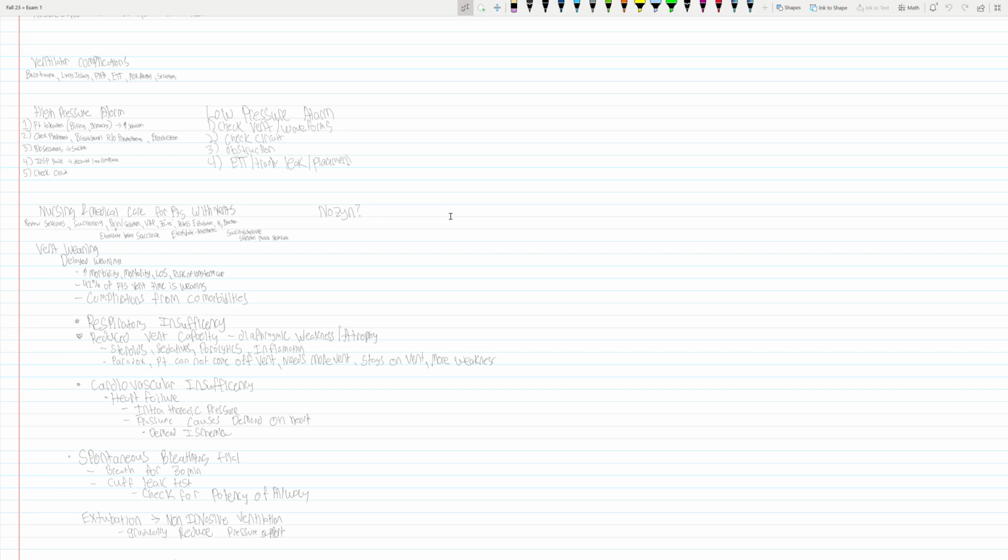So, picking up from where we left off, we are talking about nursing medical care for patients with ventilators. We want to make sure every start of shift, we're reviewing the settings. Like I said earlier, every intervention requires removing that intervention. So maybe we can change the settings to a lower setting to start weaning the patient off.